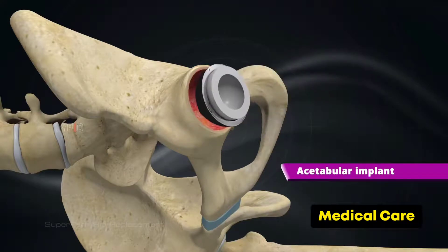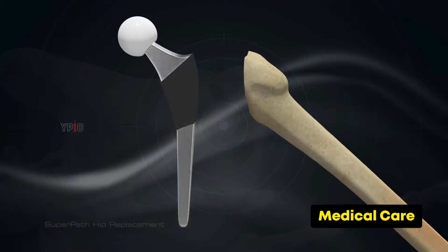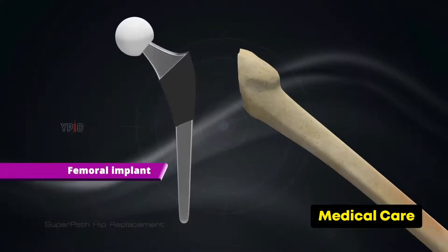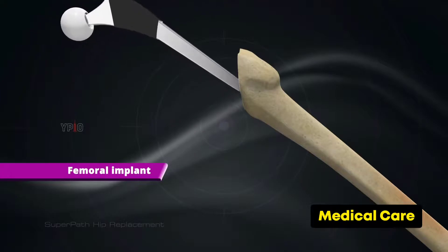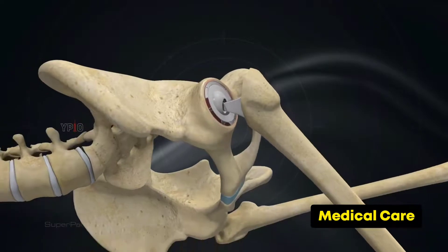A dome-shaped acetabular implant is placed into the socket. The femoral head is replaced by the femoral implant, resembling a ball on a stick, which fits into the previously prepared neck and body of the femur.